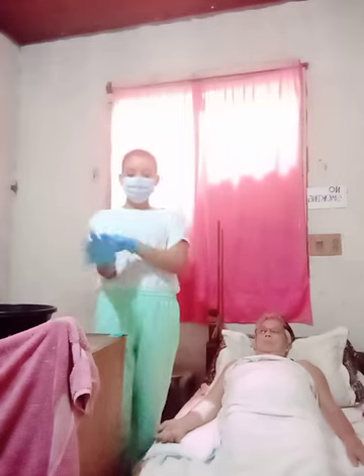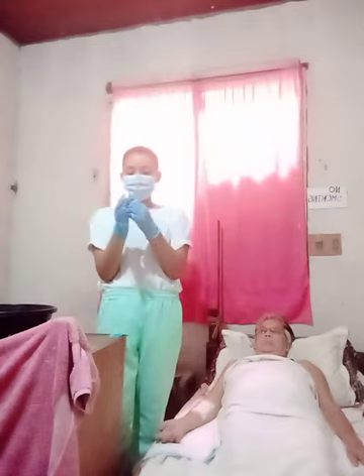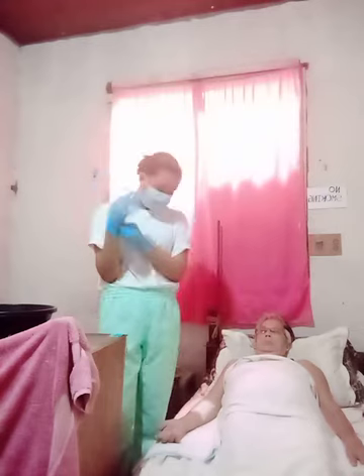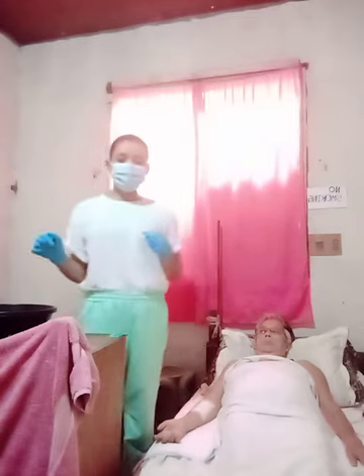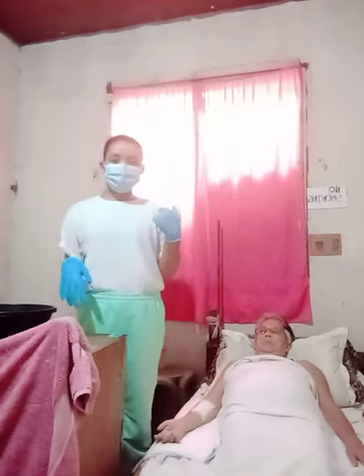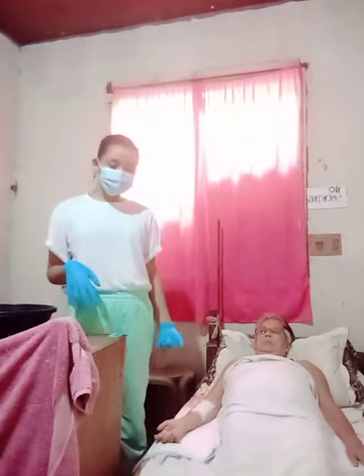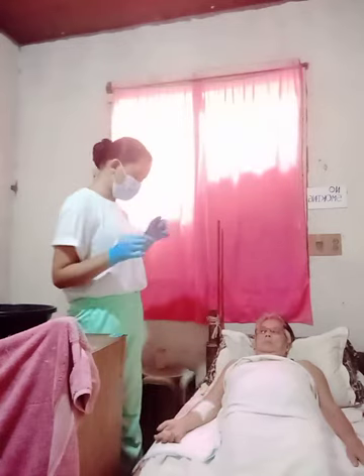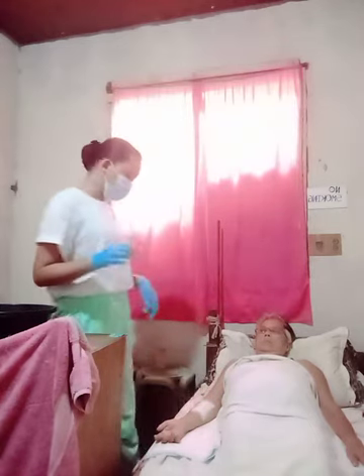After putting on the gloves, the next procedure is to remove the tape. Pull parallel to the skin, then pull toward the dressing, and remove the remaining adhesive from the skin.